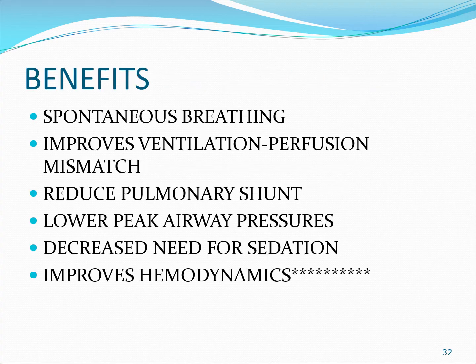Some of the benefits of APRV: spontaneous breathing. It also improves ventilation perfusion mismatches. It reduces pulmonary shunting. It uses lower peak airway pressure, which decreases ventilator-induced lung injury. It decreases the need for sedation, and because you work at lower pressures, it improves your hemodynamics. So these are some of the benefits of APRV.